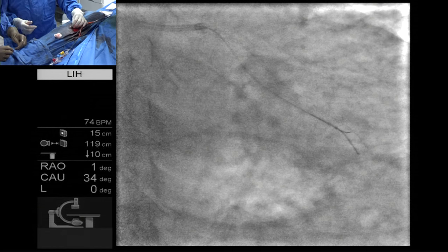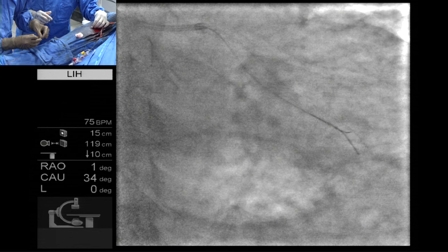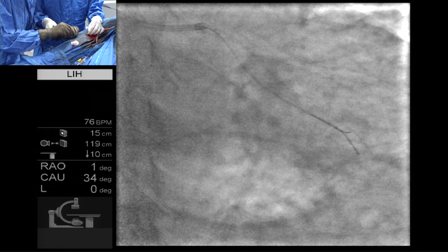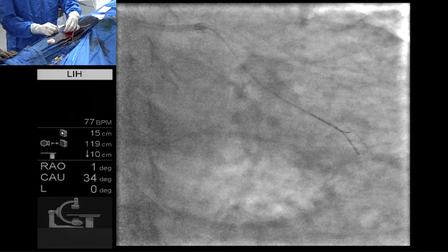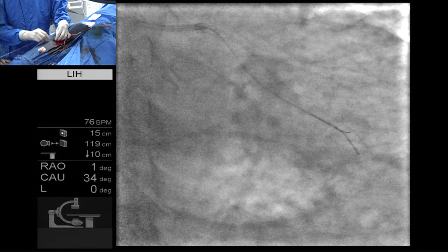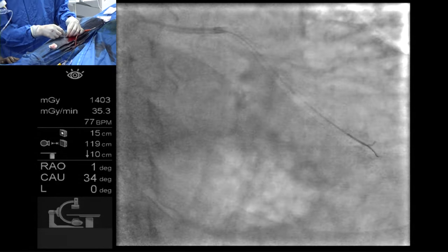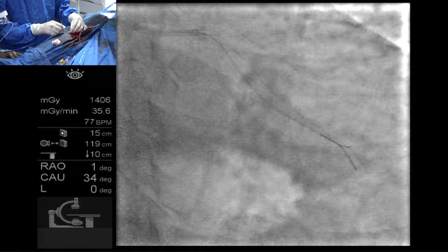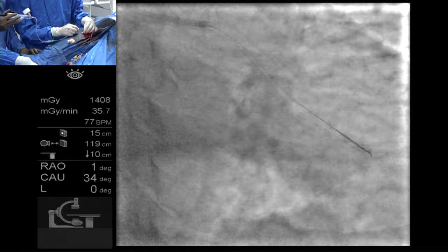I think this may be the best time to take Guide Plus 2, putting both the wires inside the guide extension catheter. I never use it, but okay. I like the suggestion. But I think we need some micro catheter to go close first. If the 1.5 balloon cannot go, I don't know if the guide extension can go down this way. They're saying there is a 1.0 balloon in the lab also, if you want to use 1.0 balloon.